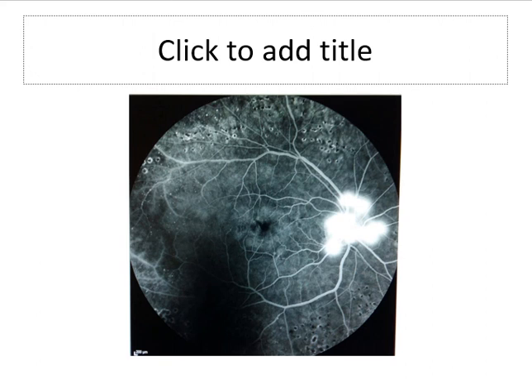Hence, fluorescein angiogram is a very useful test to confirm neovascularization before deciding on treatment in patients where clinically it is not very obvious. Secondly, fluorescein angiogram also helps in assessing the macula to look for any macular ischemia or macular edema, which helps in deciding treatment.